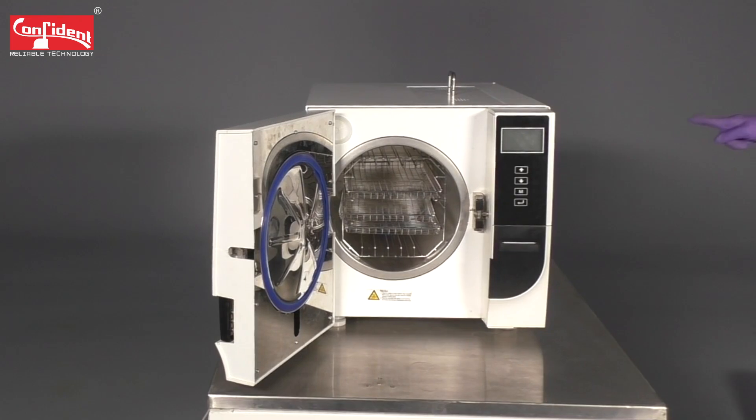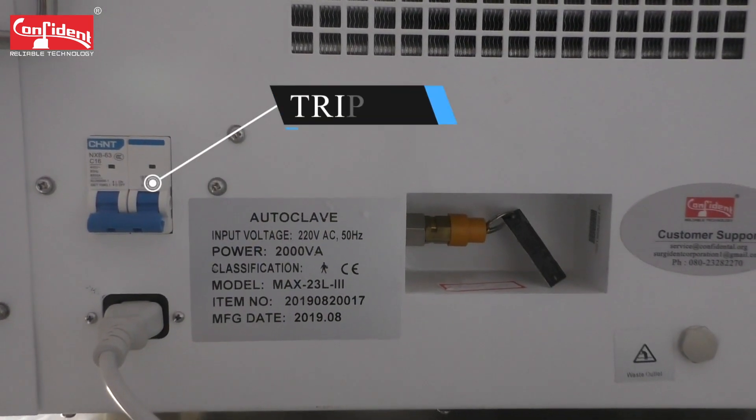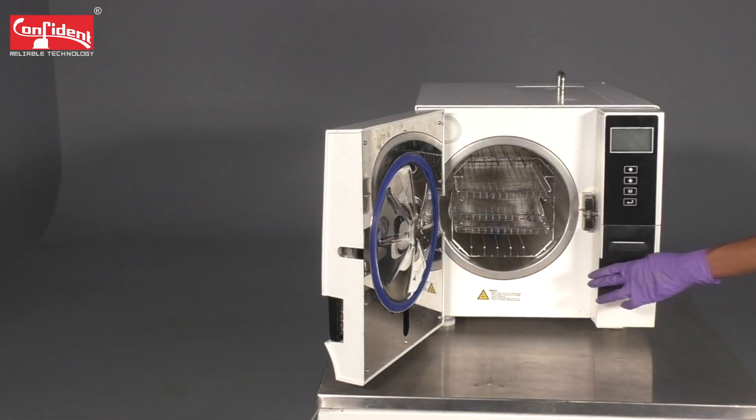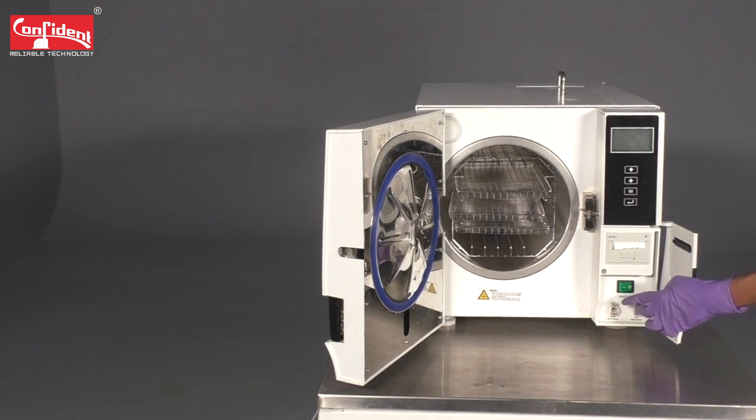Now switch on the device using the tripper which is located at the back of the device. To switch on the display, open the panel and turn on the green switch.